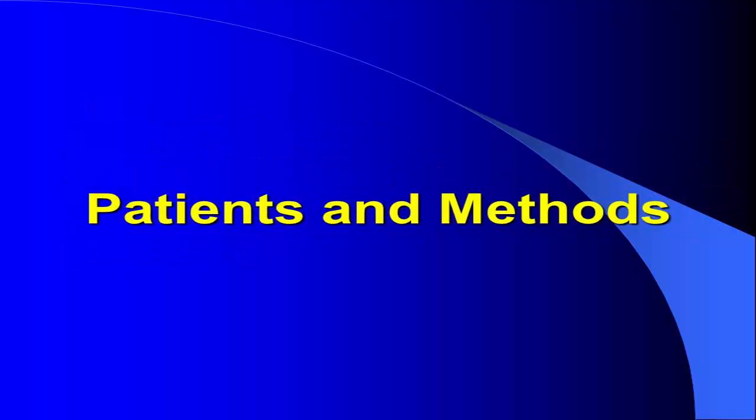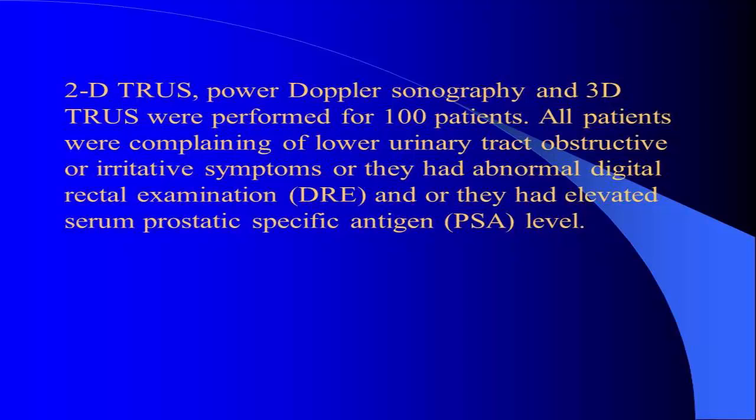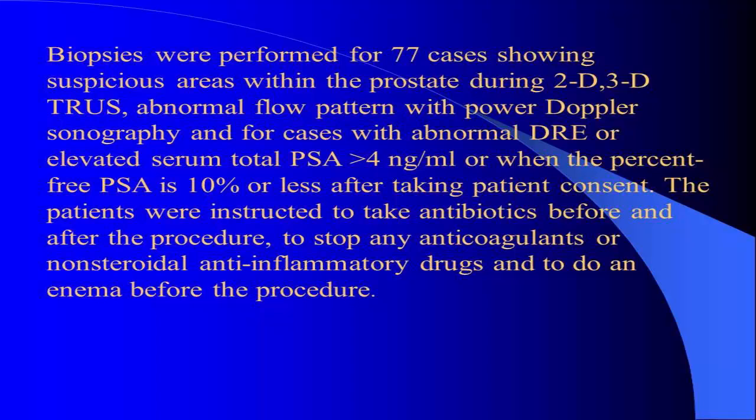Methodology: two-dimensional transrectal ultrasound, power Doppler sonography, and 3D ultrasonography were performed for 100 patients. All patients were complaining of lower urinary tract obstructive and/or irritative symptoms. Among them, 77 patients were subjected to transrectal guided biopsy.